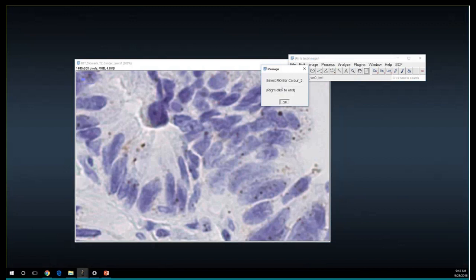You need to select the second color, which, let's say you select this color. Now, this selection is wrong because in that particular pixel, there is a mix between hematoxylin and the probe itself. So this will affect the deconvolution itself. So let's see what happened.